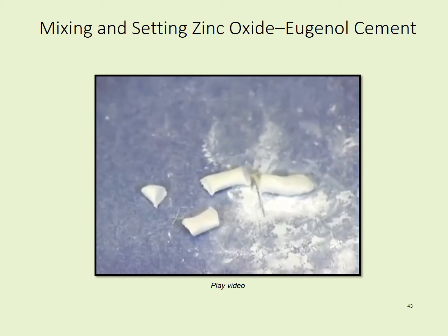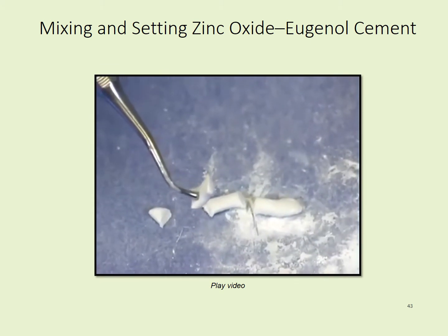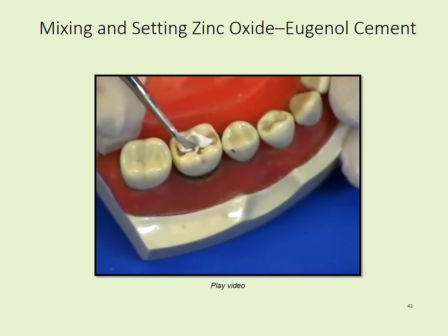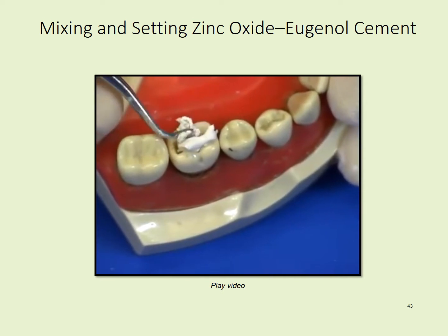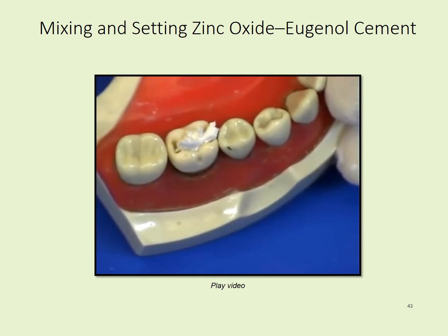Using a condenser, carry 1 small piece to the cavity preparation. Pack the cement into place with the condenser. If the cement sticks to the condenser, dip the end in the powder. Continue adding increments of cement and condensing until the entire cavity is filled.